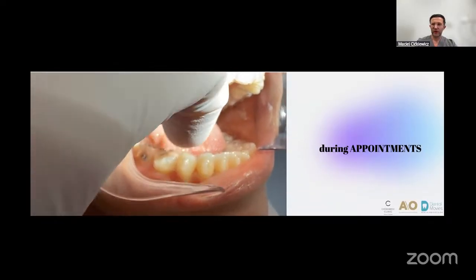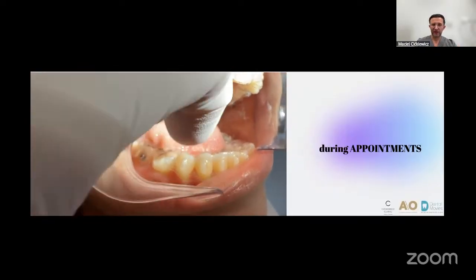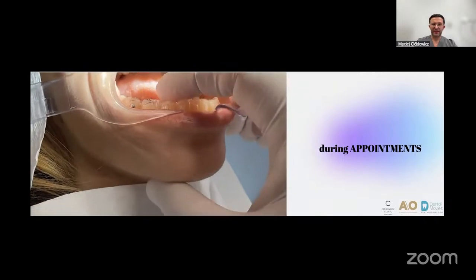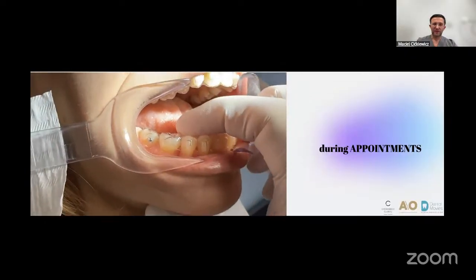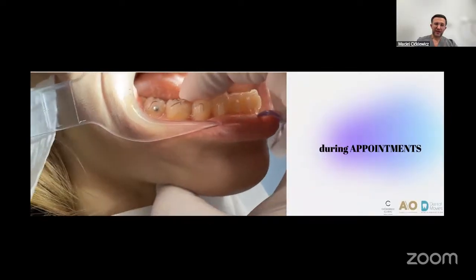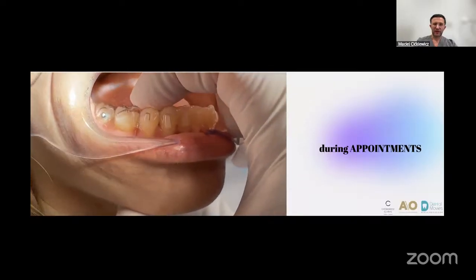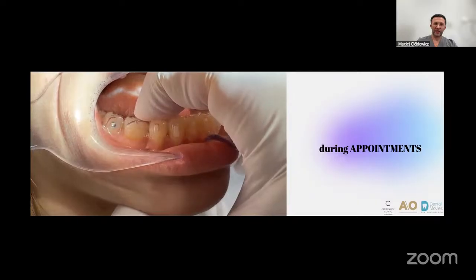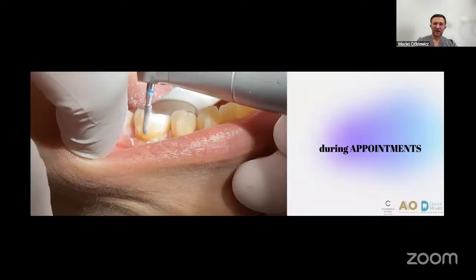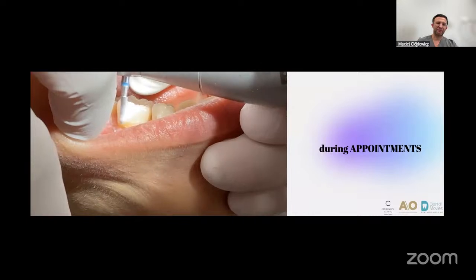So here, on the visit, we can push the aligner, but sometimes it's difficult to do. So then we take the bur and we clean the elements of the attachments from the tooth. And then, if we clean it, we take the new one by pushing the aligner. So we try to create the new one by making a pressure.